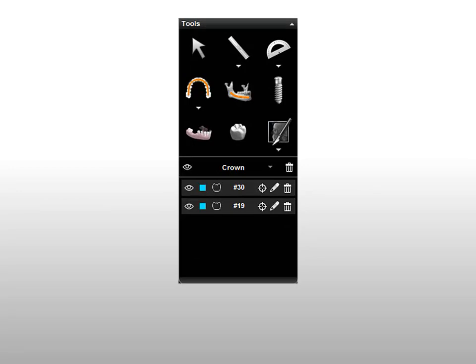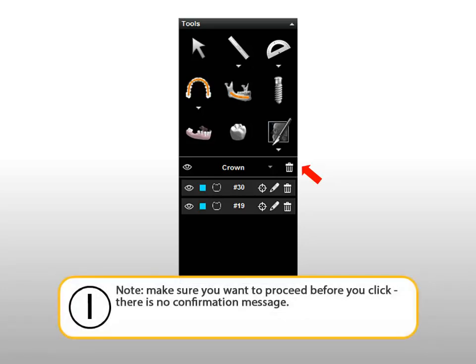To delete crowns, click the trash can alongside the individual crown you want to delete. Or, to remove all crowns, click the trash can at the top of the crown section. Make sure you want to proceed before you click the trash can, as no confirmation message is displayed.